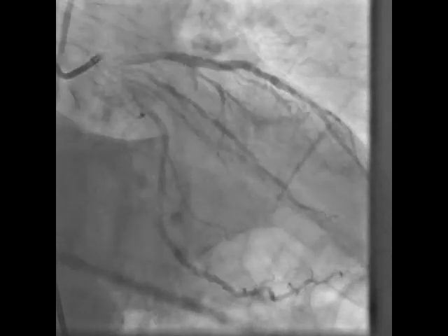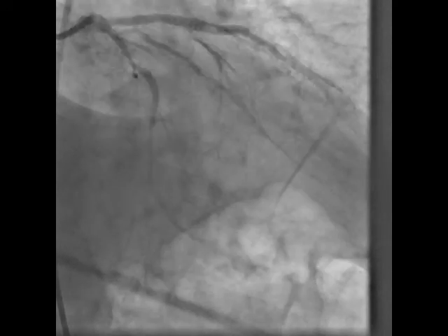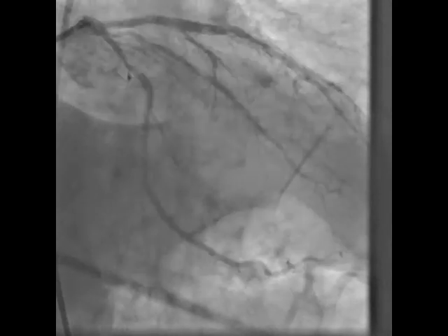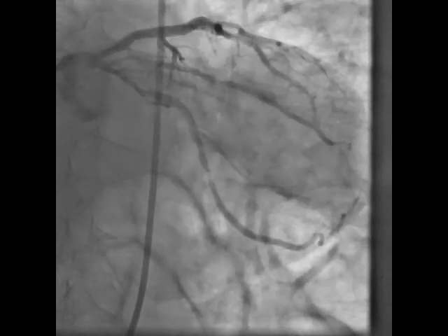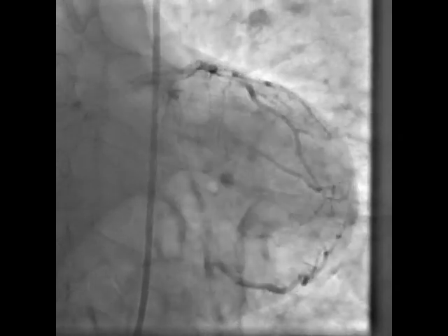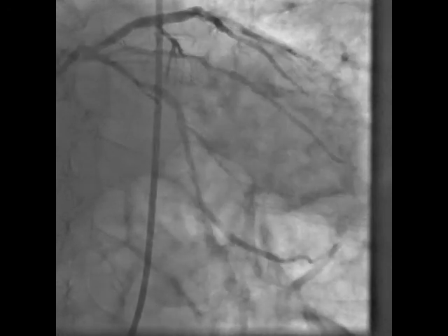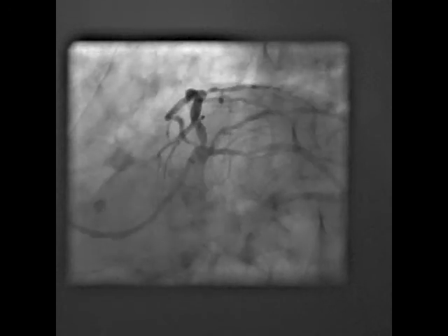In this slide you can see a coronary angiogram which shows the patent stent in the left anterior descending artery, and in the circumflex artery there are two discrete areas of atheroma. Overall the arteries have a very atheromatous appearance, and clearly in such a case we'd want to target our stenting to areas most likely to give us physiological gain.